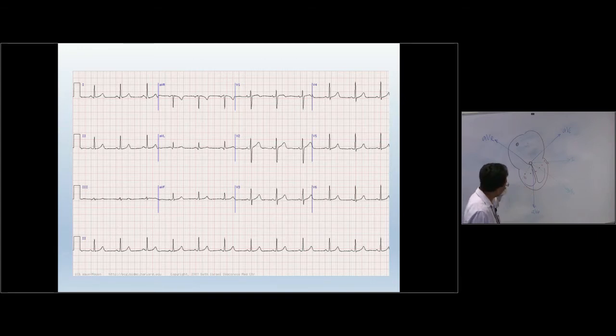Now, when it comes to clinical application, we'll consider an example. We'll assume you guys are doing a rural placement somewhere, maybe Atherton, and you've got a patient with chest pain. So you did an ECG, and the doctor looked at the ECG and comments, this patient has an inferior infarction. To make that comment, the doctor needs to look at the inferior leads. That means the leads which are facing towards the inferior part of the heart, or the leads which are gathering electrical activity of the inferior, diaphragmatic surface of the heart.